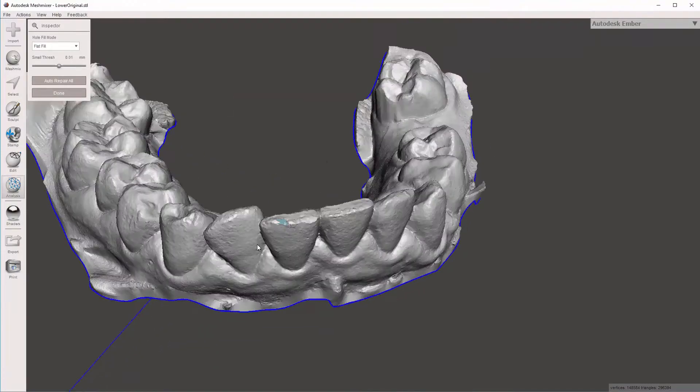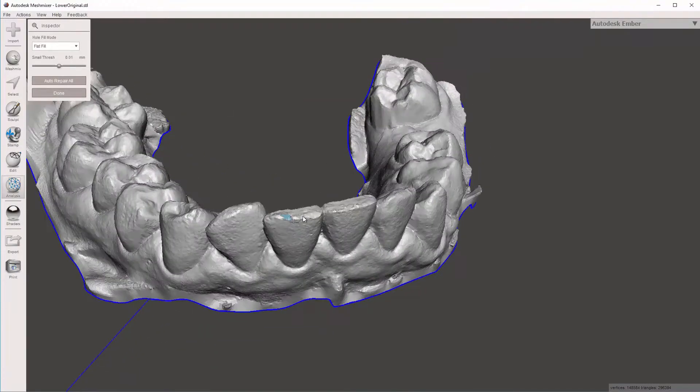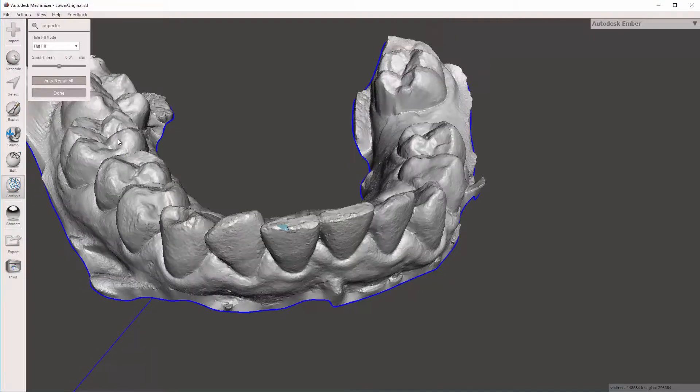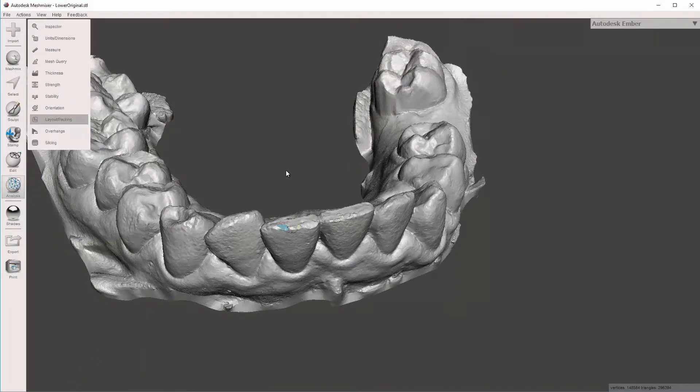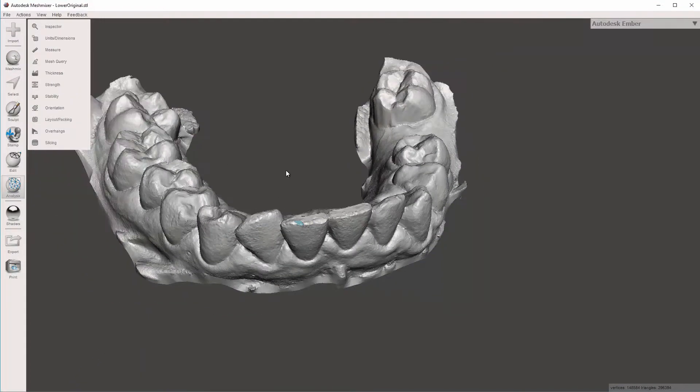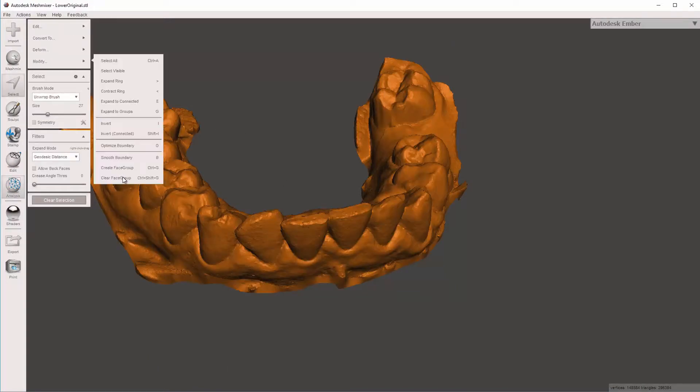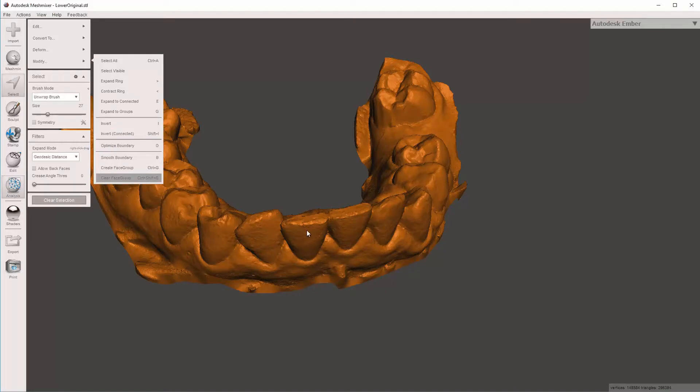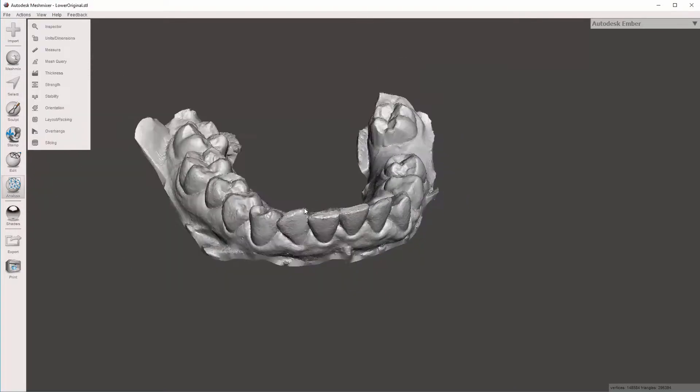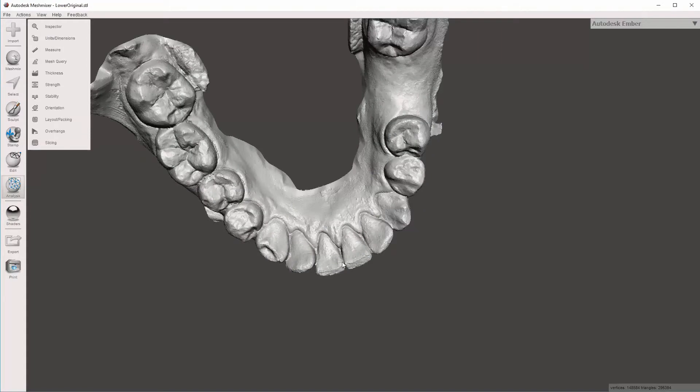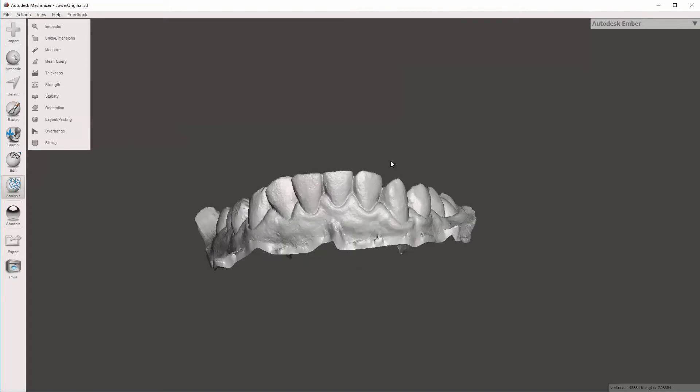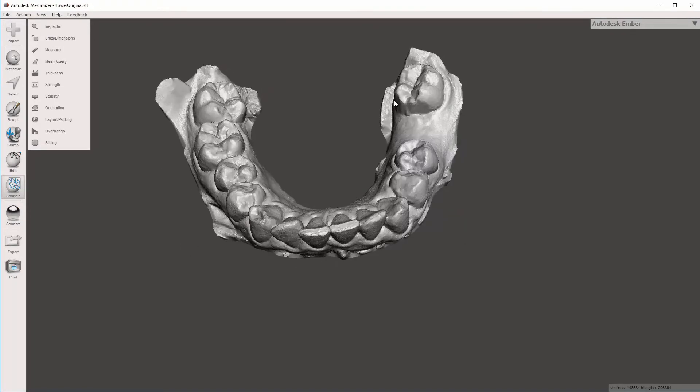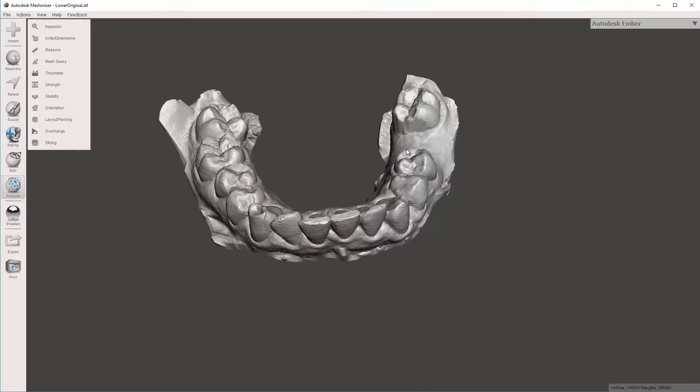Not a big deal, but if you don't like the fact that there are different colors, to fix that very quickly, hit Control-A, which will select All. Come to Modify, Clear Face Group, or Control-Shift-G. Now it's all one solid color. That is how we correct models for holes.